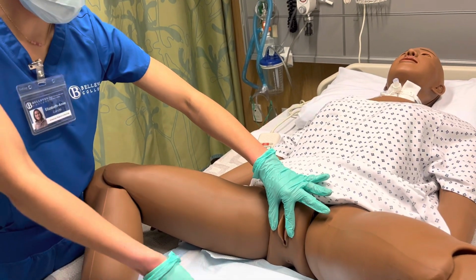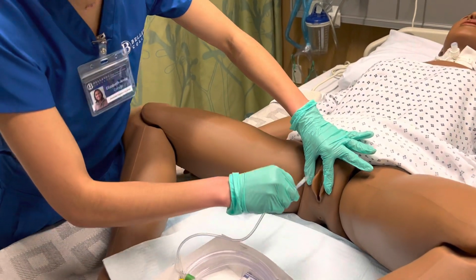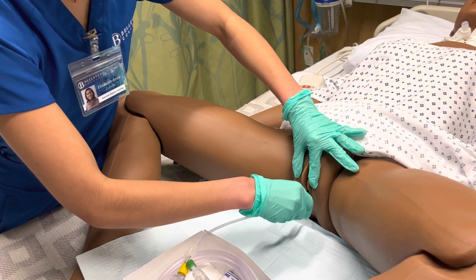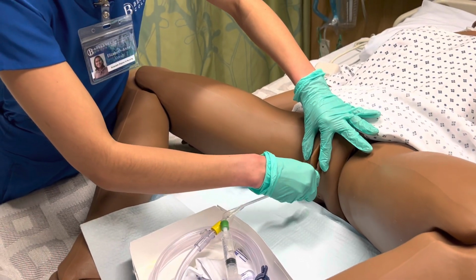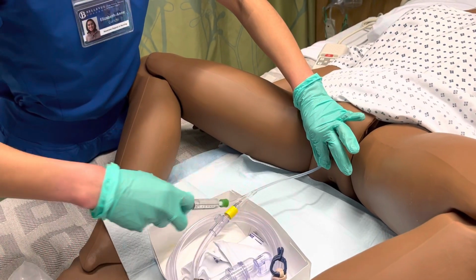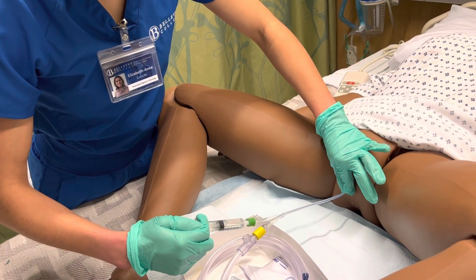Okay, now I can take my lubricated catheter and we're going to go into the meatus, and we will see a flash of urine there, and then we'll insert a little bit further, and I'm going to hold that secure while I inflate my balloon.